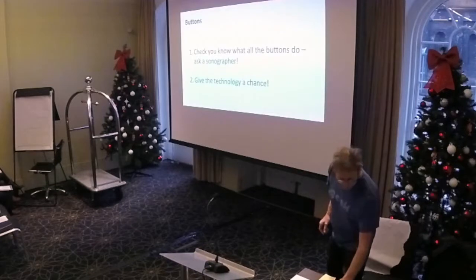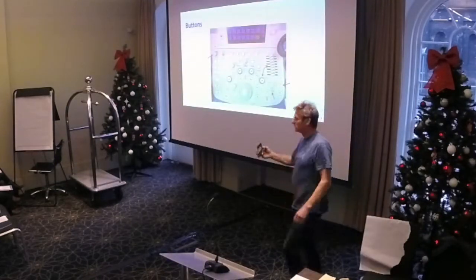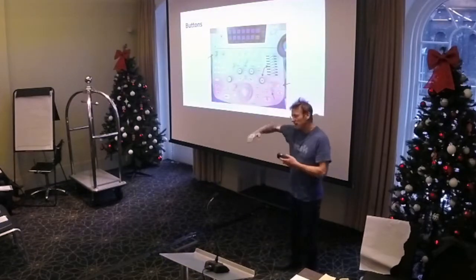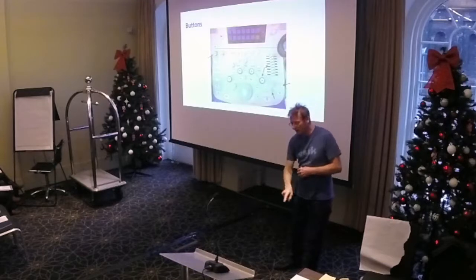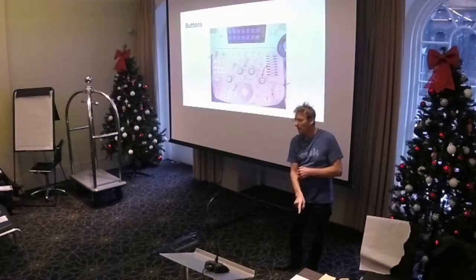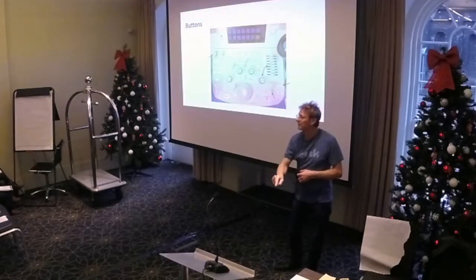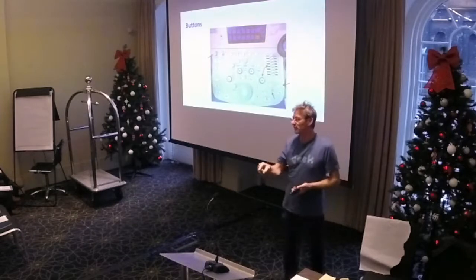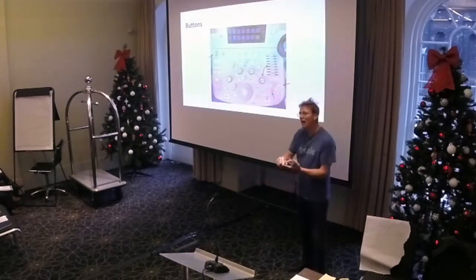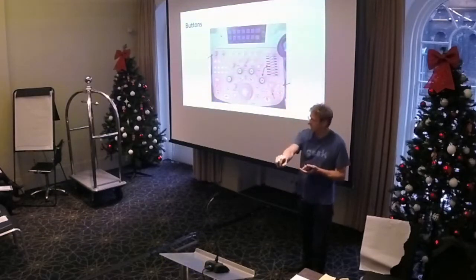So I'm just going to talk about some of the basic buttons. Let's talk about a scan machine in general. You've got a curvilinear array in obstetrics, and there's a row of crystals, and they're firing an ultrasound beam out, and it hits something that's harder than the bit it's just come through, and it bounces back. It knows how fast that's going. It's about 1,500 meters per second in water, and then it times how long it takes for the signals to come back. Then it calculates the time, measures the strength, and puts a dot on the screen there.